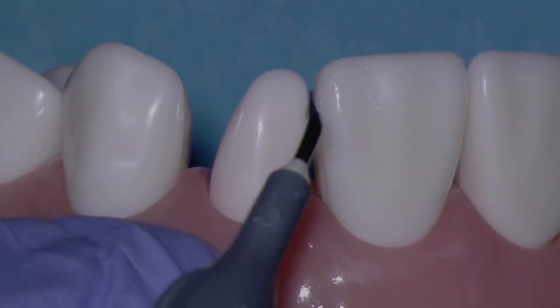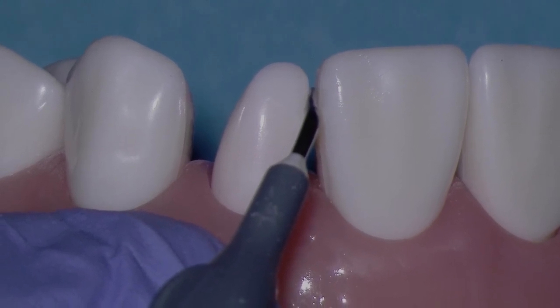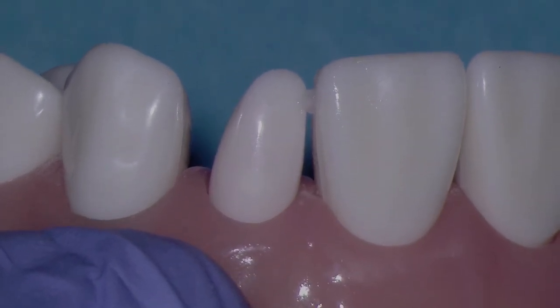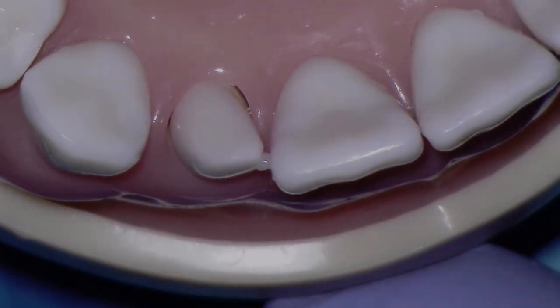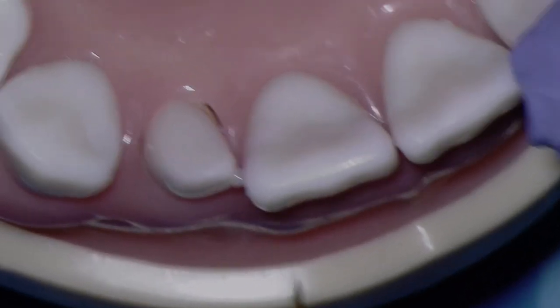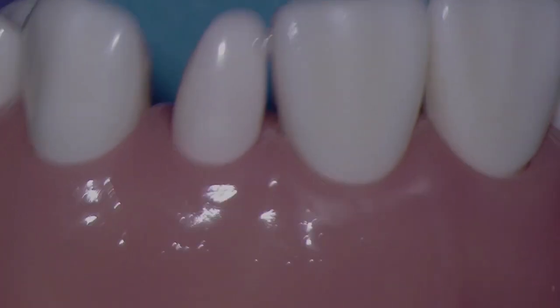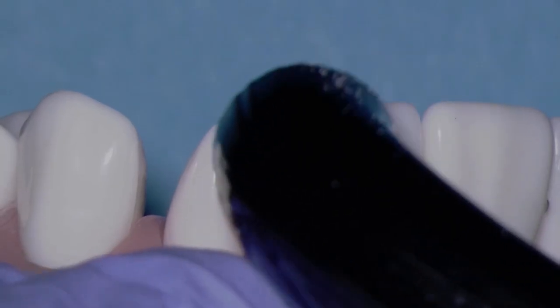So we come in, we put this dot of cold flowable composite at the contact area. That's going to be right in the middle of the contact, just like this. We'll put a dot of cold flowable composite at the contact area. That's going to be in the heart of the future contact. We don't want this to be too far to the facial or to the palatal, like I was saying. You want it right in the heart of the contact, both buccolingually and occlusogingivally. Let's go ahead now and cure.